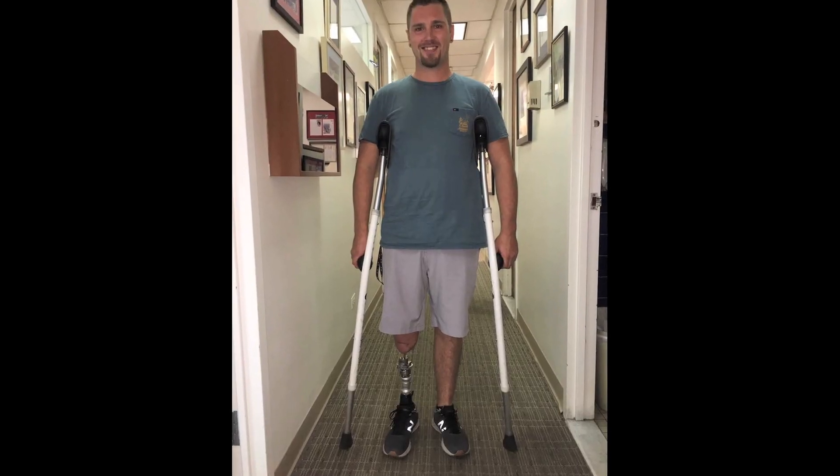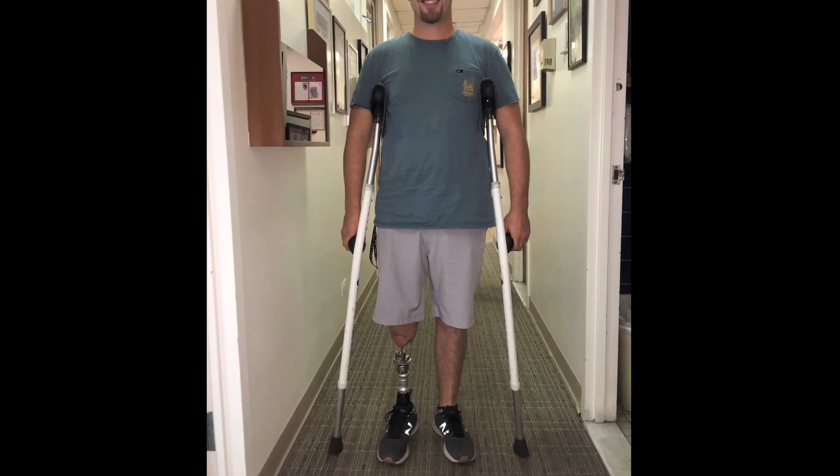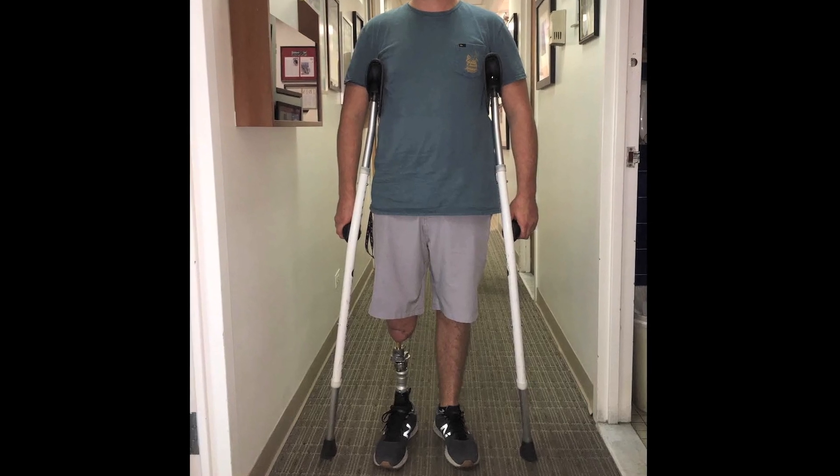At a certain point, once we're comfortable with the extent of osseointegration, we attach the leg to the abutment. Then we start with crutches and progress the weight bearing gradually until they're fully weight bearing.